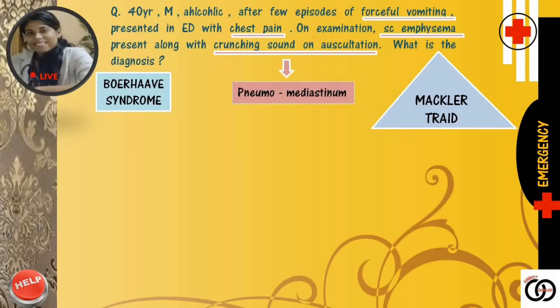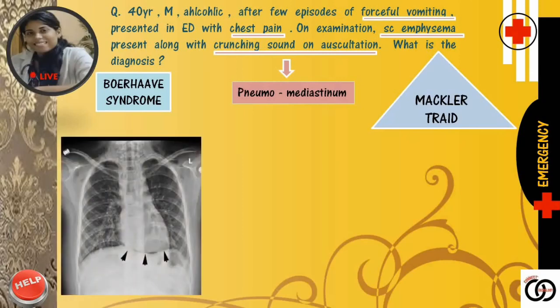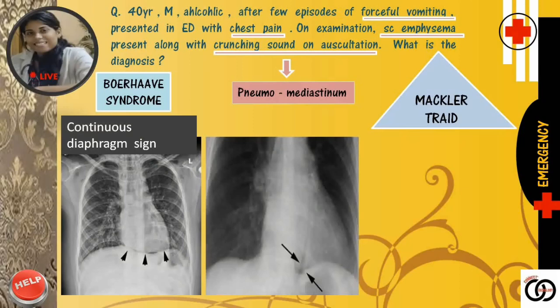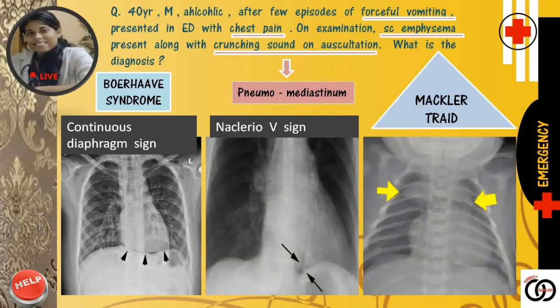On chest X-ray, let's see the findings. See the first film — appreciate the continuous diaphragm sign. This is because air collects beneath the pericardium, so the central part of the diaphragm becomes visible as well. See the second film — appreciate the V, the air outlining the descending aorta and the left diaphragm. This V is classically described for pneumomediastinum secondary to esophageal rupture — this is known as Naclerio's V sign. And see the third film — appreciate the spinnaker sail sign, which is actually air outlining the thymic lobes in a child.